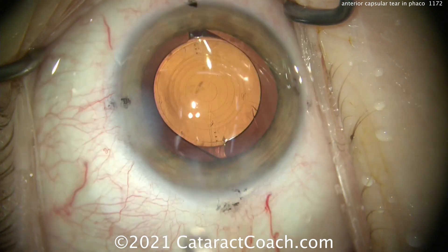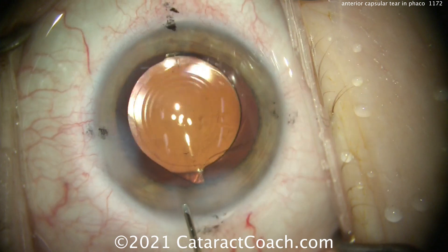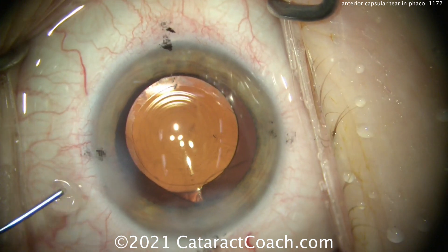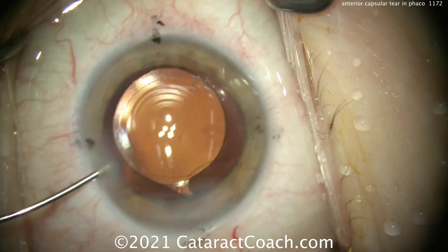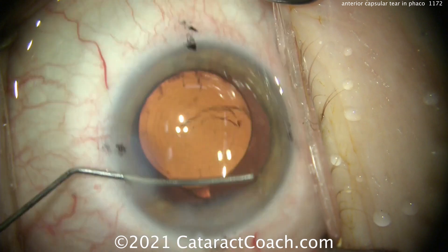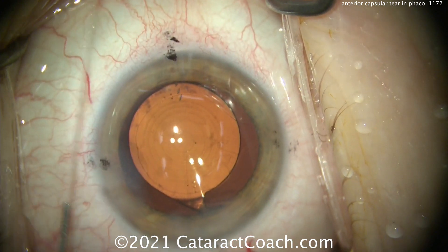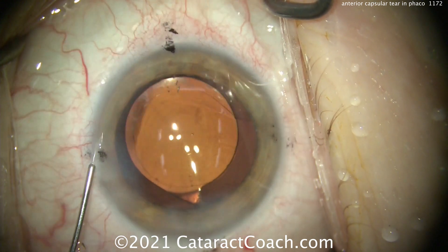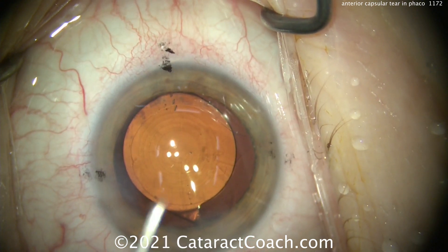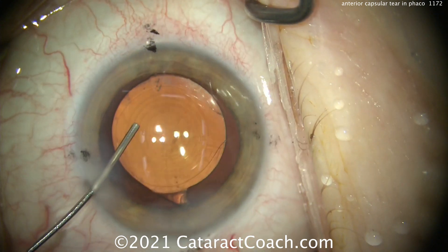Now again, not letting the AC collapse — getting it hydrated. You saw that technique of using two hands, injecting with the one hand through the paracentesis, while the other hand was pulling the IA probe out. Now there may still be a little viscoelastic left, so let's just do an angle sweep here. We'll get all that out and angle sweep it, and that'll come out the paracentesis. Now let's seat it up and double-check the positioning — it looks great.